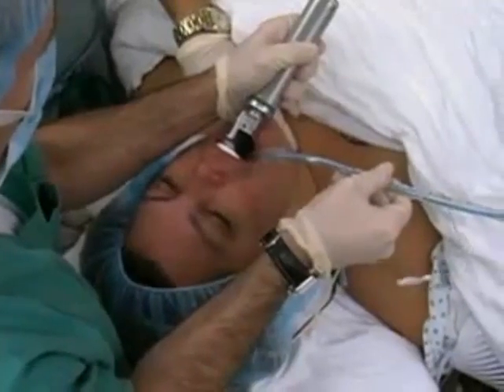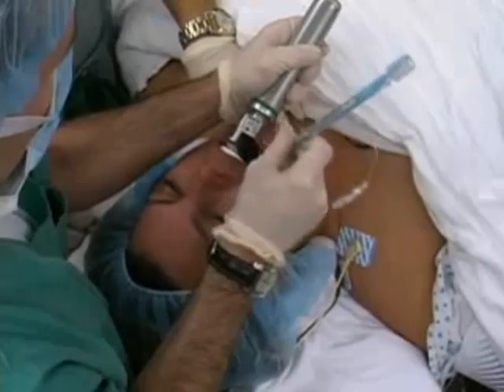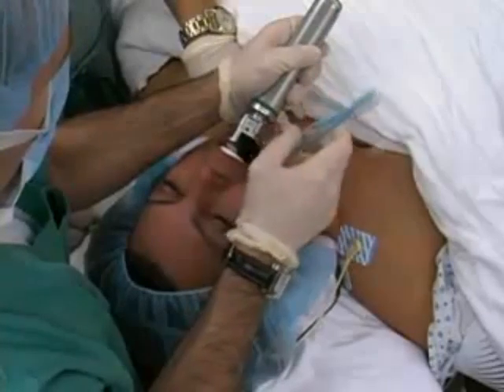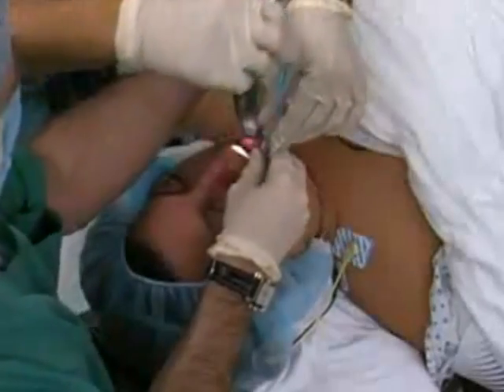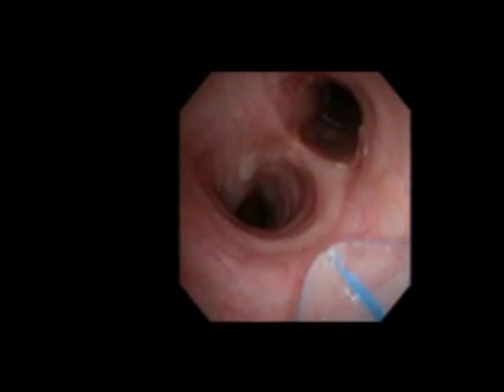Place the endotracheal tube in the right side of the mouth, advancing it toward the glottic opening. The tube should not obscure your view of the glottic opening, and you should watch the tube pass through the vocal cords. If a stylet is used, it should be removed immediately after the endotracheal tube passes through the cords. Continue to insert the tube to a depth 2 centimeters above the carina. From an endoscopic viewpoint, you can appreciate the appropriate depth of the endotracheal tube in relation to the carina.